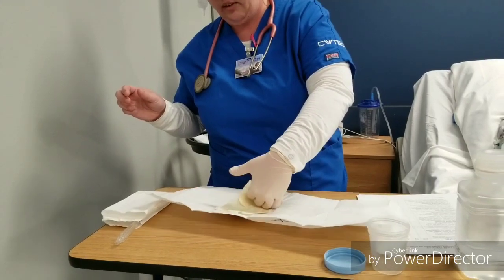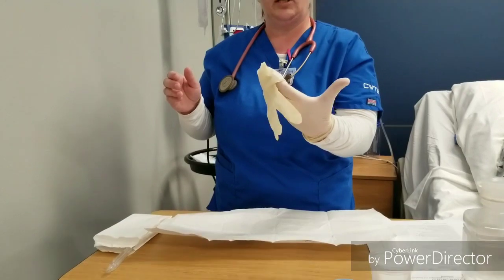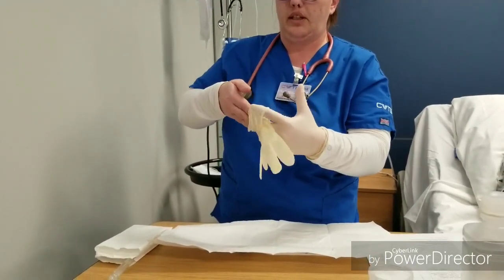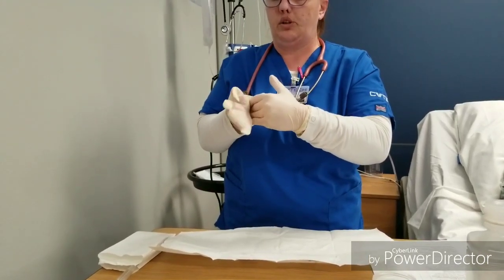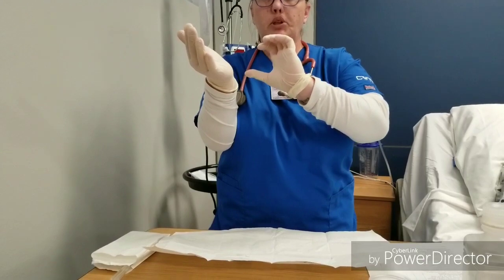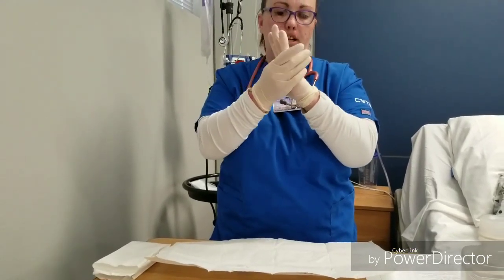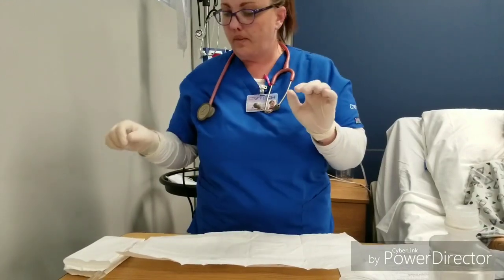grab under the cuff, and you want to make sure your thumb is abducted where you look like a hitchhiker. Place this in so you don't accidentally touch this thumb with your non-sterile hand. Goes on. Now you don't want to touch anything below your wrist because that is not sterile. So if you need to adjust your fingers, you can now. And you want to keep your hands above your waist. Patient's good.